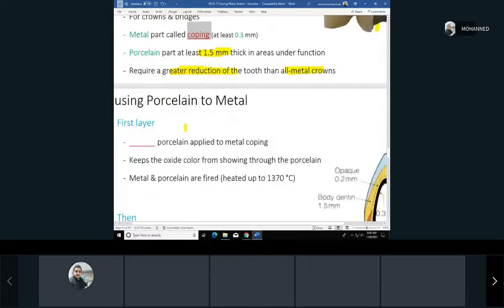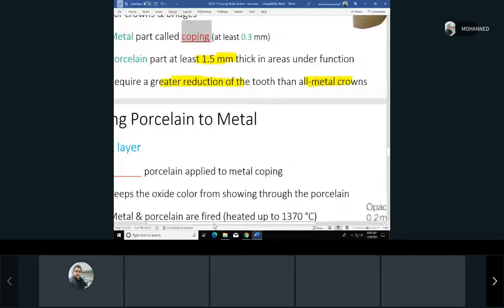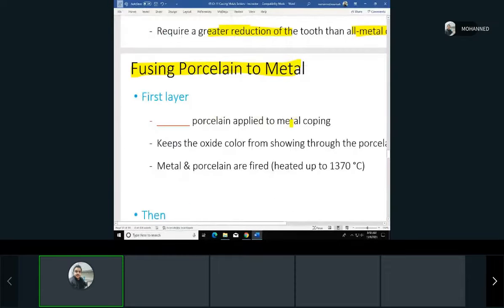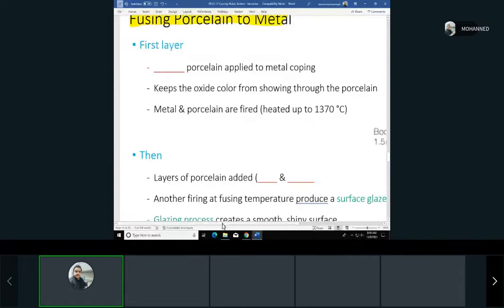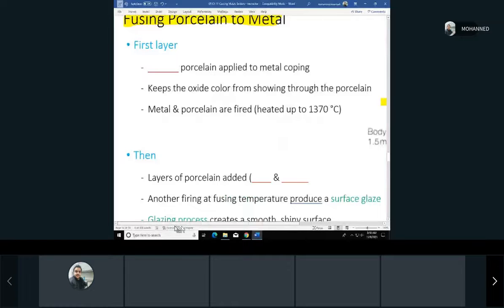Okay. So when we're talking about the porcelain fused to metal, the way that we're actually doing it, as we saw in the video, technically they layer it, right? So the first layer that will go onto the coping. See, this is the metal coping that you see in here. That's the tooth. This is the metal coping in black, right? The first layer that goes in there, we call an opaque porcelain.